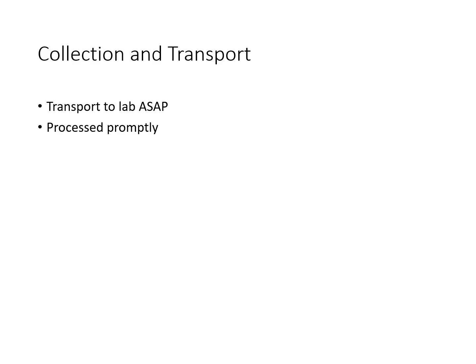For transport to the laboratory, we want this to happen as soon as possible. Fungal samples should reach the lab as quickly as possible to help maintain their viability. Any delays can cause loss of viability, changes in morphology, and overgrowth of contaminants. We need to make sure we use appropriate containers, such as sterile, leak-proof containers. Paper envelopes or bags are preferred over plastic to avoid moisture buildup, which can actually cause fungal overgrowth or decay.